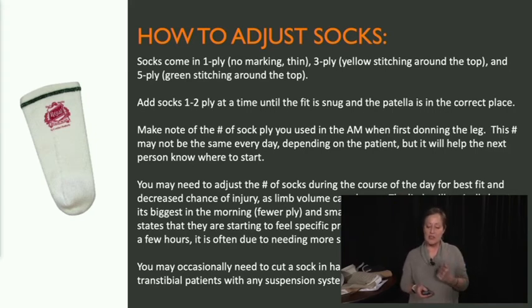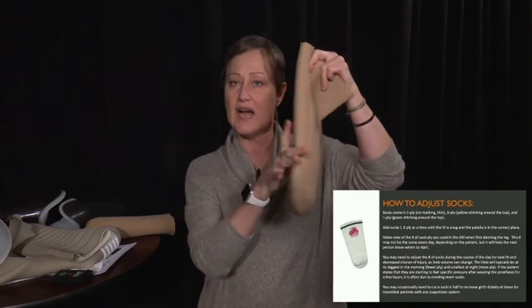So I mentioned most of these points already. You might need to adjust the number of socks throughout the course of the day. I like to tell patients early on, you need to have a sock or two in your pocket when you're leaving the house, because you do not know when you're going to need socks for the first several months. It can take up to 2 years for the volume of a limb to stabilize so that somebody doesn't need to add socks anymore. And by then they've got at least one new socket, or maybe a second new socket. You can also, even for a regular cushion liner for a suction, cut a sock in half.